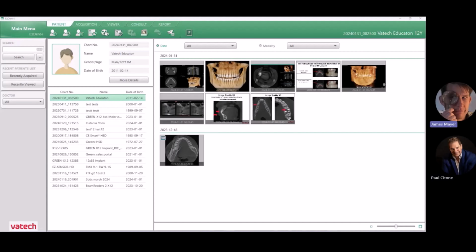So Paul, we just went through patient positioning on the cone beam here, and I think it's important to do a little bit of talking about CT image quality and evaluation. Would you agree? Yeah, absolutely. Taking a look at your images immediately after you take them is a great idea to verify you captured the proper anatomy and making sure everything looks the way it should. For sure. And I think that also does then the patient's still there, and then do I need to retake the image because I've just evaluated?